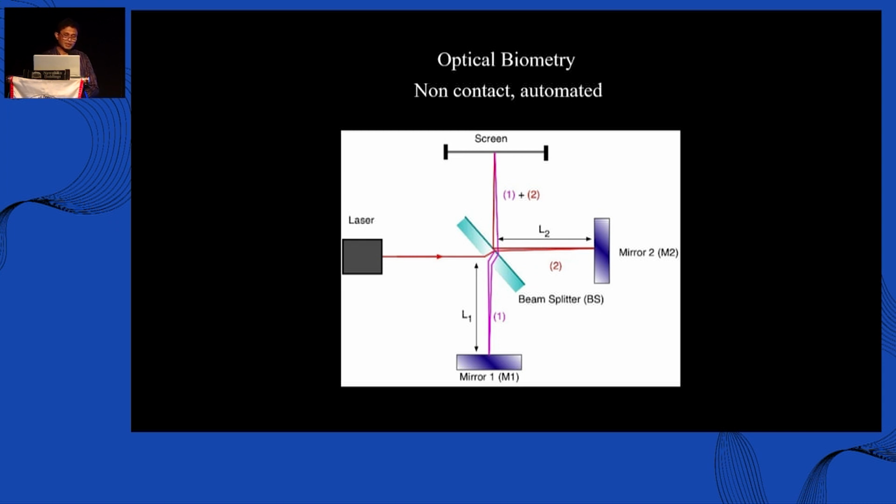You split the beam, make 2 rays out of one laser, and then you send one through the tissue, the other to a reference place, and then compare. Then you can reconstruct in a different format. So that's the difference between sound, ultrasound, and beam splitting in laser light optics.